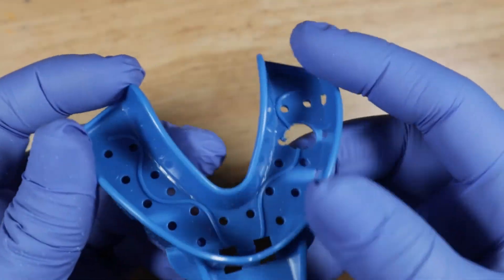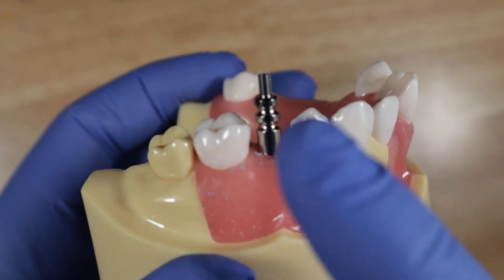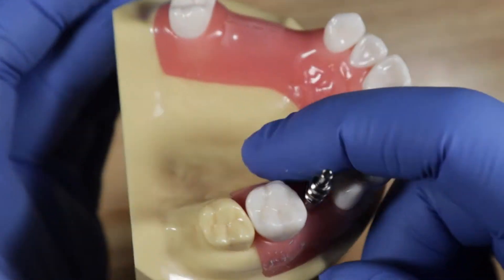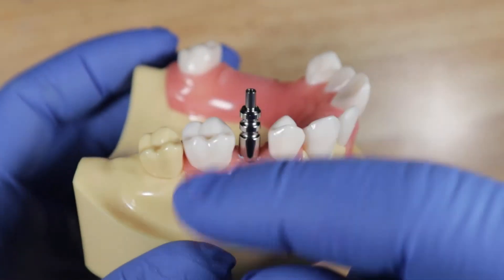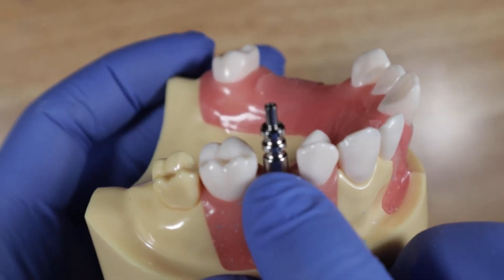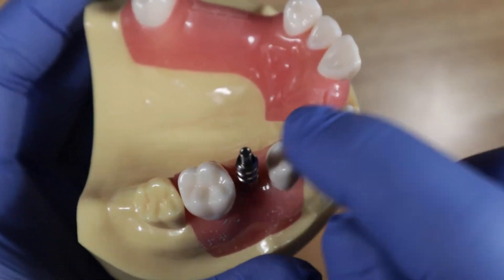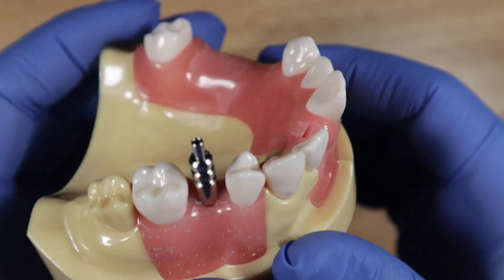As your assistant loads the tray with heavy body impression material, express light body around the impression coping. You want to go on the buccal and the lingual — capture all the way circumferentially around the impression coping — because you want it to catch the grooves and get a good impression. Also express a little light body on the occlusal surfaces of the adjacent teeth.